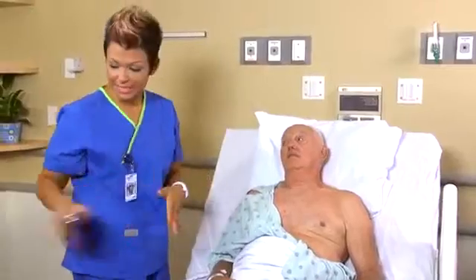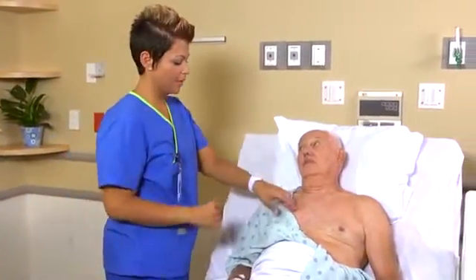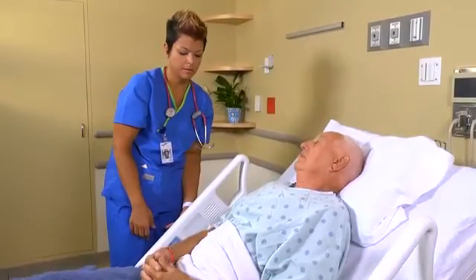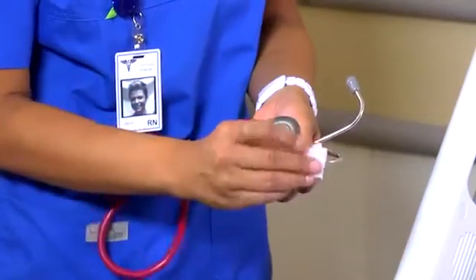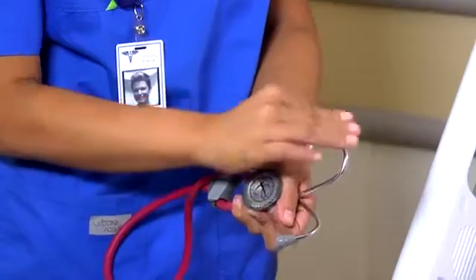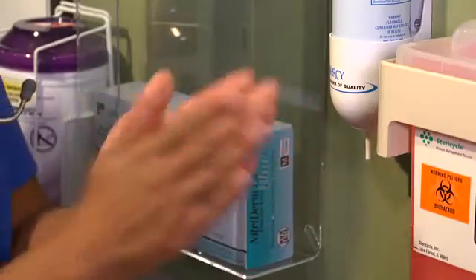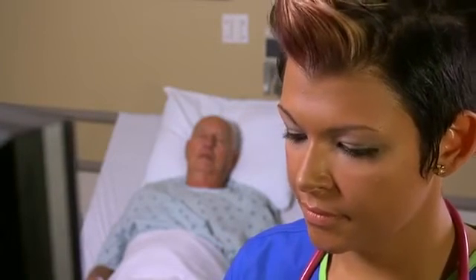Okay, Mr. Davis, your heart rate is 64, which is good. It's within normal range. Then replace the patient's gown and bed linen, help them into a comfortable position, and discuss your findings if appropriate. Clean the earpieces and diaphragm of the stethoscope with an alcohol swab routinely after each use, and discard the swab in an appropriate receptacle. Perform hand hygiene. As part of your follow-up, compare the patient's pulse rate and rhythm with his baseline and with the acceptable range for his age.